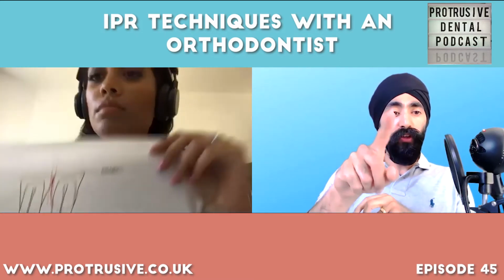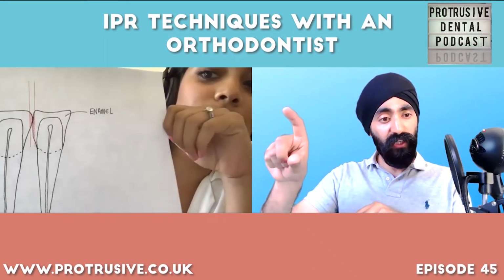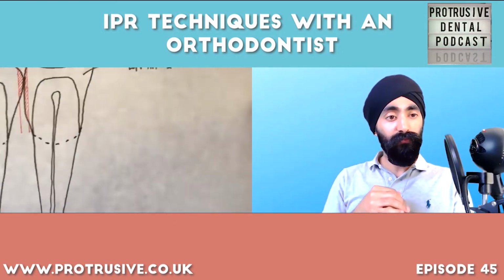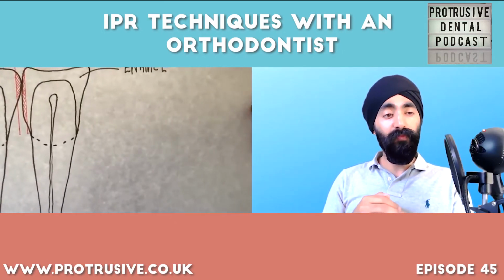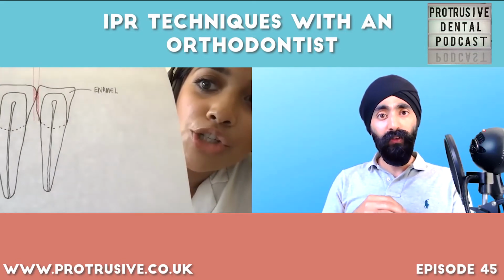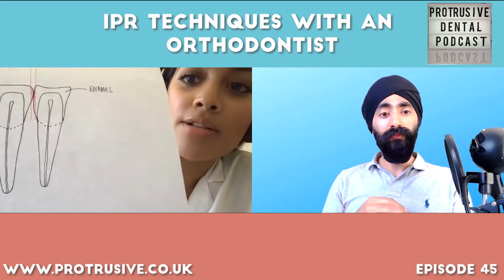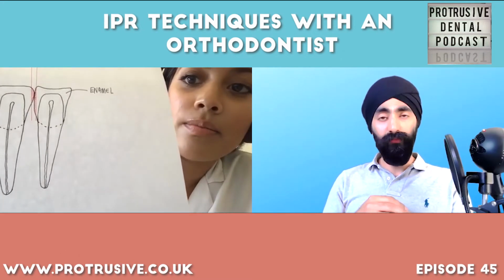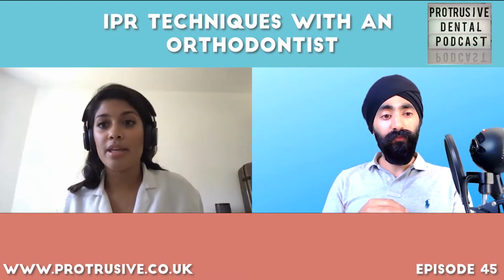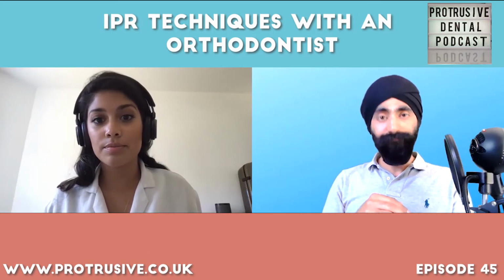So the tooth on your right was the triangular one, whereas the one on your left is the rectangular one, yeah? Exactly. So you can see how it affects the amount of enamel you take away. Big time. But then imagine that tooth tissue removed, then you've got parallel edges. You would then use that to relieve your crowding and then move the teeth together. But then I think it's also good to mention something to your patients, and also for us to know as well, is black triangles.